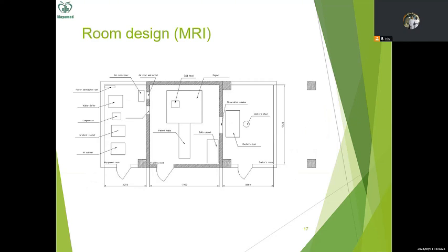In this schematic, we can see that if we remember the last table, for MRI systems, we need at least 3 rooms. They are the equipment room, shielding room, and the doctor's room. From left to right, the equipment room, shielding room, and the doctor's room are like this. And we place the cabinets in the rooms.